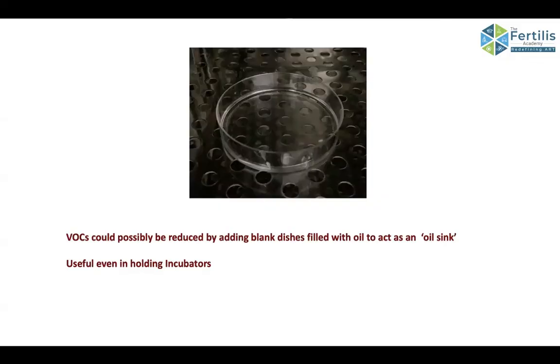You can put activated carbon in your lab. You can buy it from Eureka Forbes. You can buy activated carbon granules, and you can keep it in this dish. But all these things have a life of at least 3 to 4 days, not more than that. After that, they will start emitting VOCs. So always, when they are saturated, remove the dishes from the incubator.